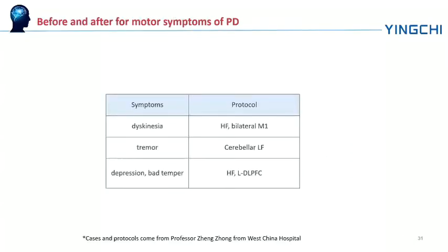So this is a case, and these are the protocols from Professor Zheng Zhong from West China Hospital. This is an old lady, and she has a son in his 30s, and the two both have Parkinson's disease, and the old lady has had Parkinson's disease for many years.